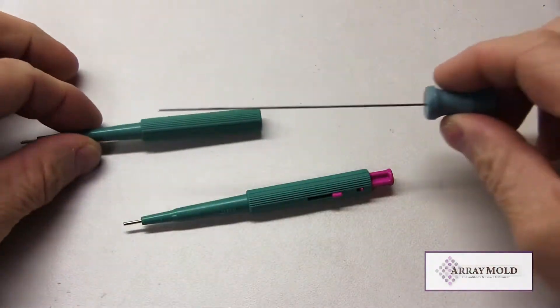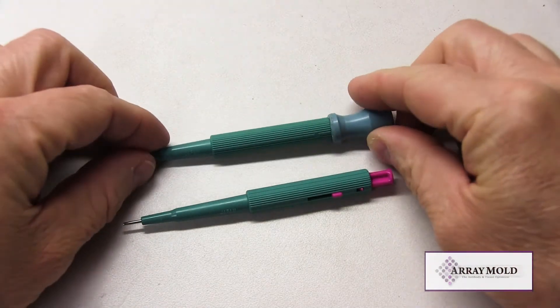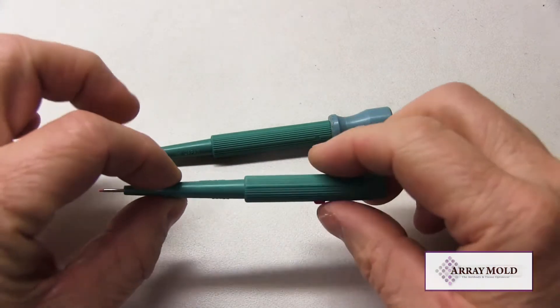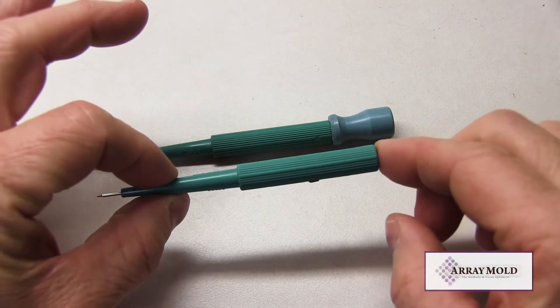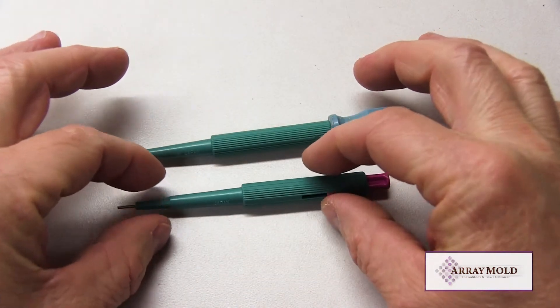The Array Mold tissue microarray instrument uses the needle without the plunger. We have added a stainless steel stylet for extracting tissues from the needle. Other TMA instrument companies currently on the market either use this plunger type needle or a custom needle.